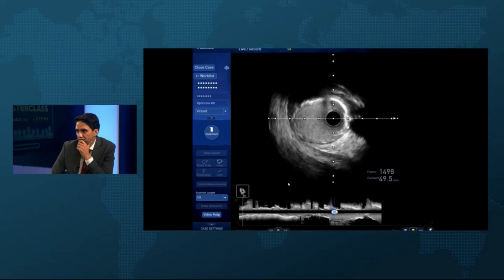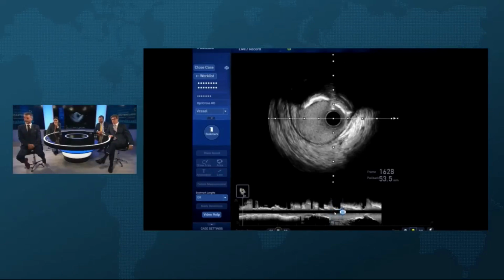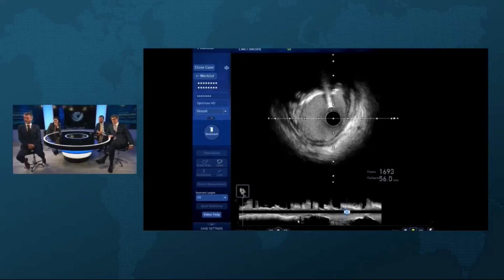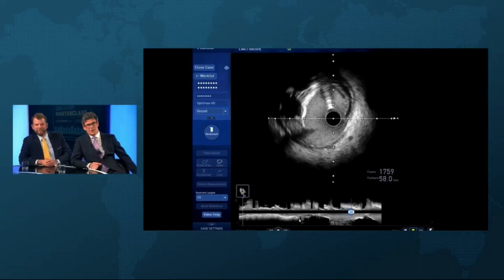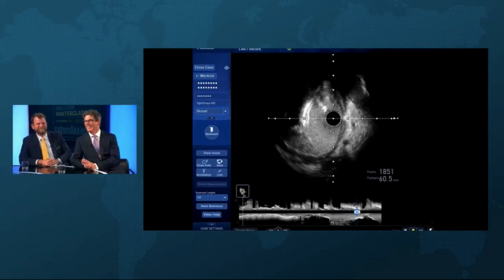So you really see it all. We see fractures, nodular, eccentric, concentric. I mean, this case is really just a master class. Pardon the pun. And you see we've got disruption down here between 6 and 9 o'clock. So it's nicely modified really there.